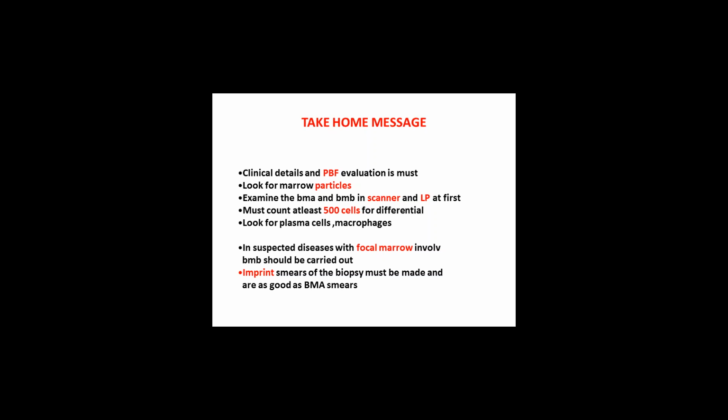Then, sir, one more question. What is the difference between monoblast and myeloblast? The amount of cytoplasm is less in a myeloblast. The nuclear size is also less. The cytoplasm is a bit basophilic, and we can get granules. That is, the primary granules are seen in blasts, in myeloblast.